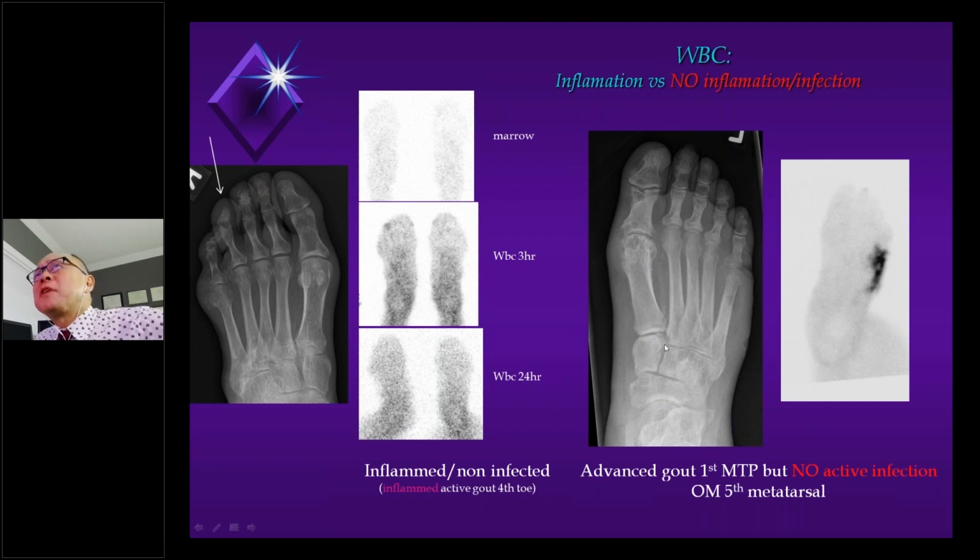As opposed to this, another example, another patient with gout, more advanced gout. You can see the erosive, destructive change. You can see very advanced gout. And he also happens to have an ulcer. So this case is ideal because it gives you a nice reference right away. In and of itself, advanced gout doesn't necessarily have to show significant infectious inflammatory activity. By contrast, this patient's deep ulcer certainly does. And so, a very nice demonstration of non-infectious and infectious.